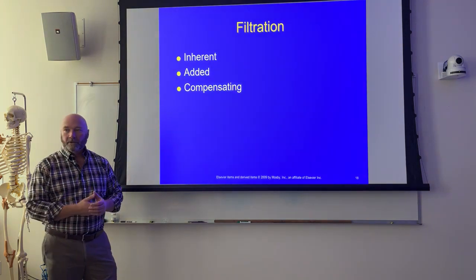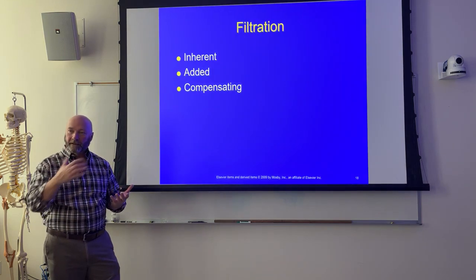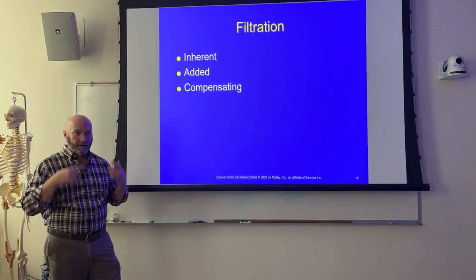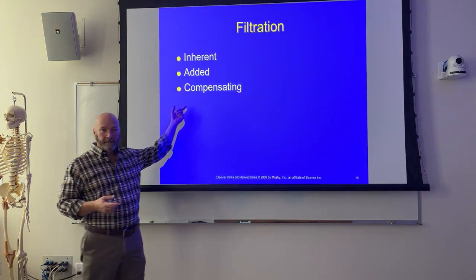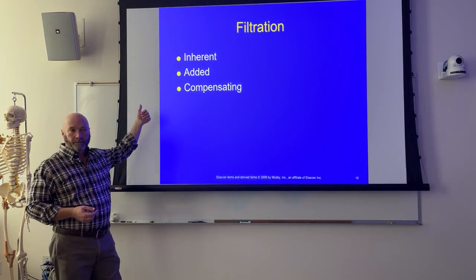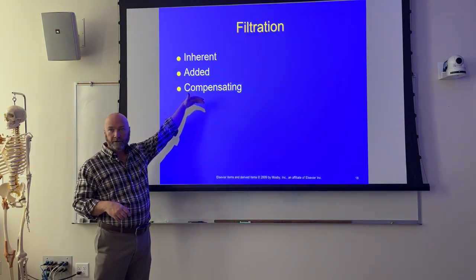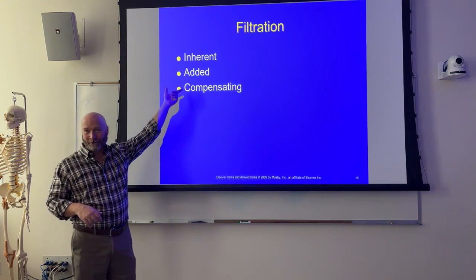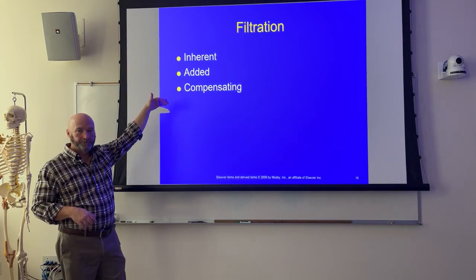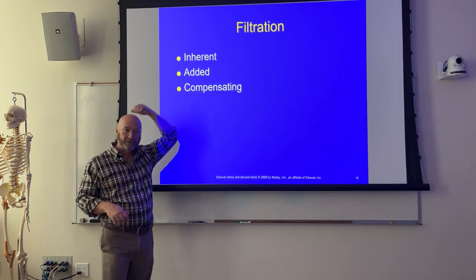And that's no. Because what we get is tanning, we get evaporation of the filament that coats the inside of the X-ray tube. You're going to have a tendency to say, yeah, well, that's added. Well, it's added, but you can't remove it, right? So you can't get inside the X-ray tube and scrape it off, so that becomes inherent filtration. It's added inherent filtration, but it's still inherent filtration. Okay, so filtration increases with the life of the X-ray tube.